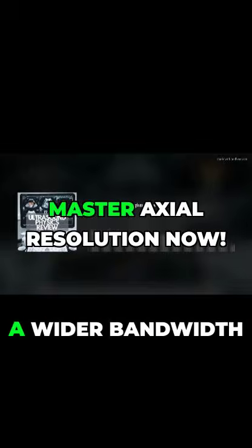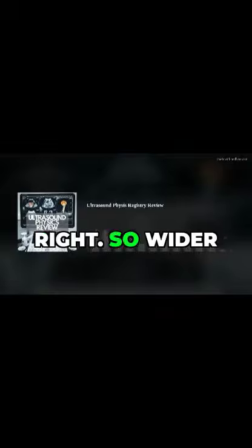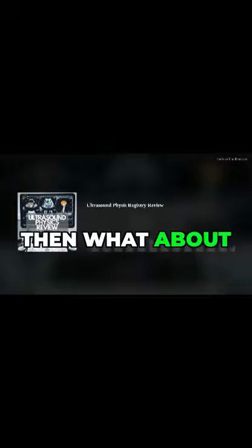And in ultrasound, a wider bandwidth is generally better because it contributes to a shorter pulse length, which we know is good for axial resolution. Right. So wider bandwidth equals better axial resolution. Exactly. Okay. And then what about Q factor?